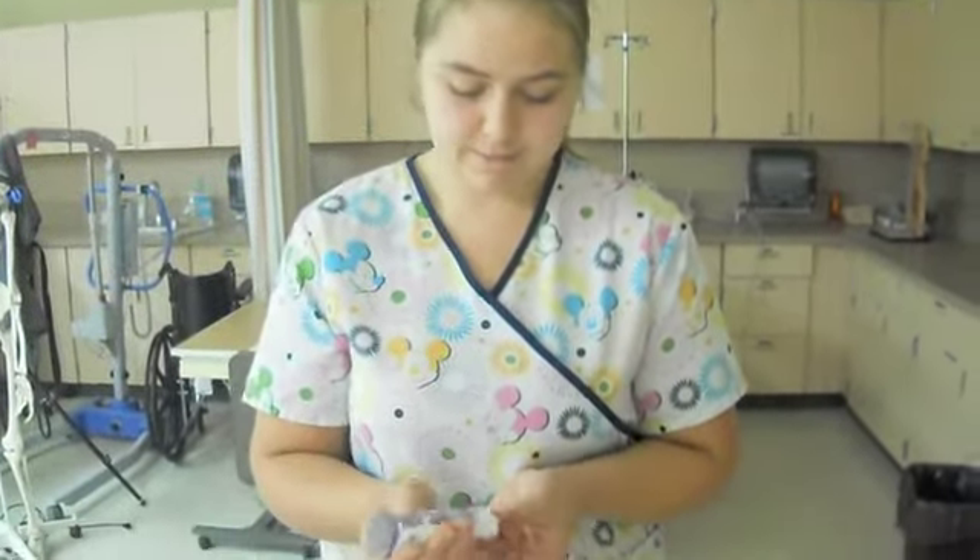All righty, first off, you're going to wash your hands. As always, first step to everything in nursing — washing your hands.